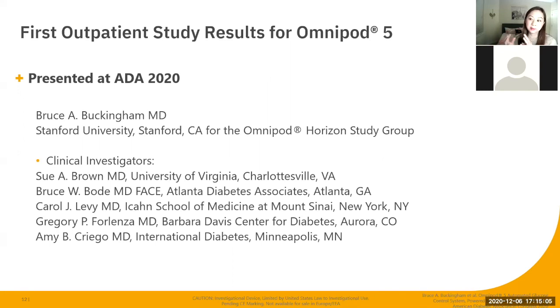And so in that investigational system, the algorithm was on the tablet, and so there was just a lot of pieces to carry. And so we weren't able to do very long studies. Our studies at max were 5 days in duration. And so we were super excited because when we shared this data, it was the very first time that our patients were at home living their own lives, doing their own thing, and actually using our system. So super exciting for us.